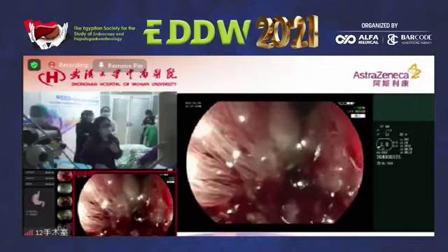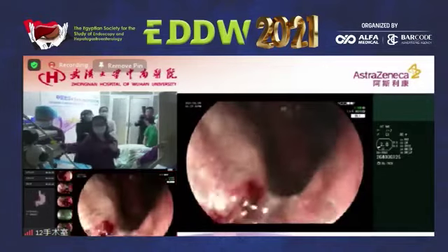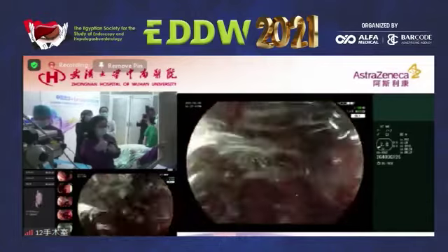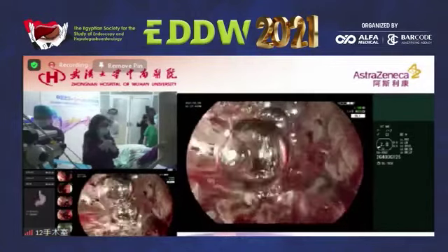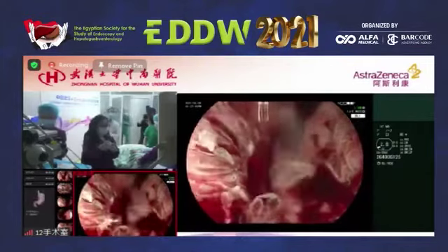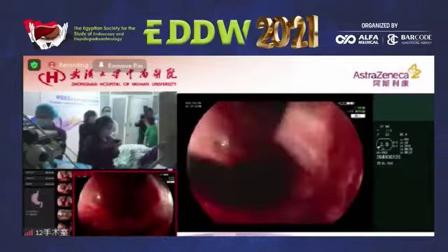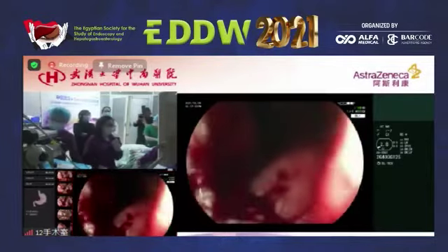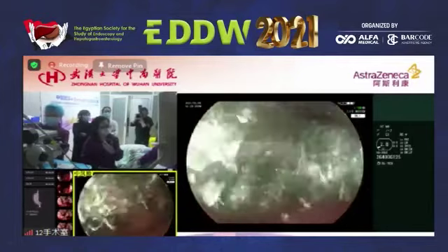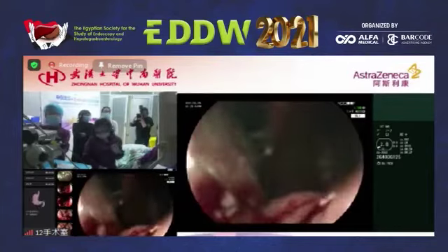Oh, it's bleeding, I can't see clearly. Dr. Nee, what makes you sure that it's a malignant ulcer? Because first, this is an old man.